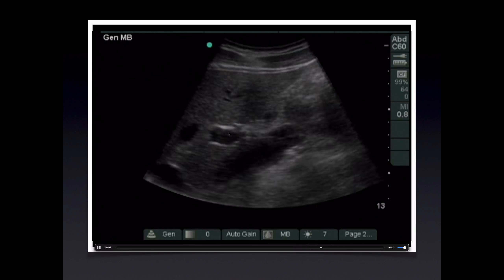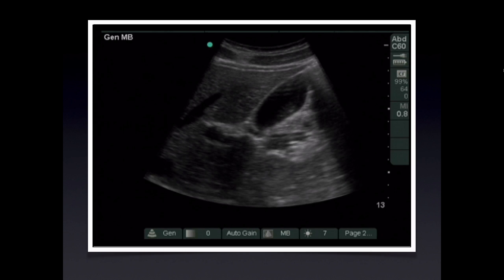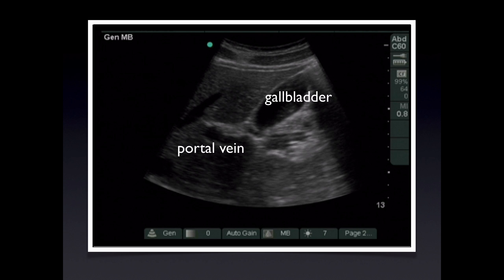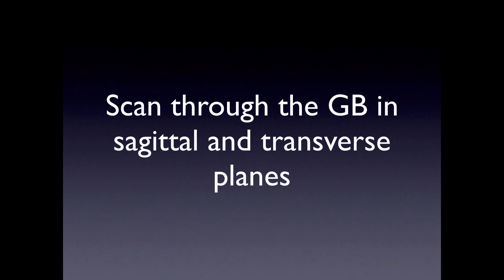The relationship to the portal vein is used to reliably identify the gallbladder. The portal vein comes within 1-2 cm of the gallbladder neck. This relationship is reliable because the cystic duct connects the gallbladder neck to the common bile duct and travels in the main lobar fissure. Once the gallbladder is reliably identified via its relationship to the portal vein, we scan through it in sagittal and transverse planes.